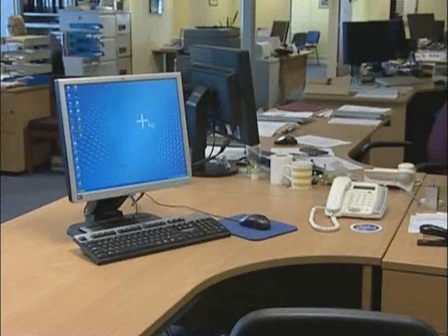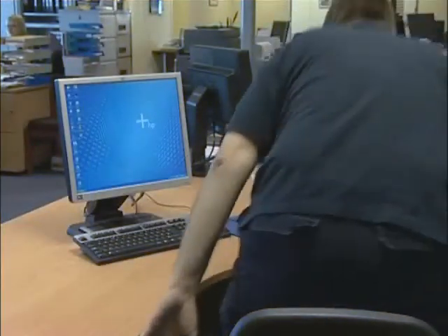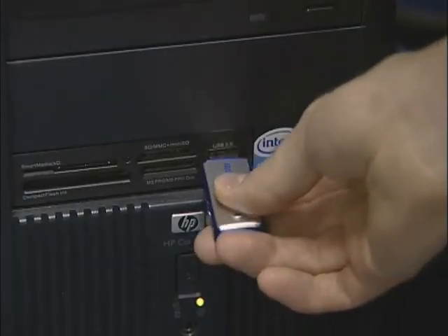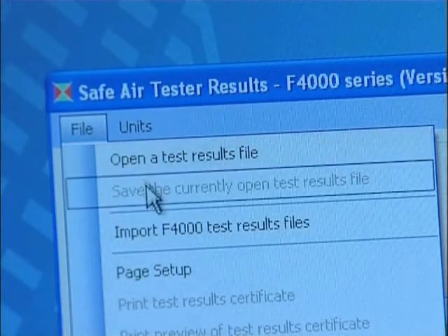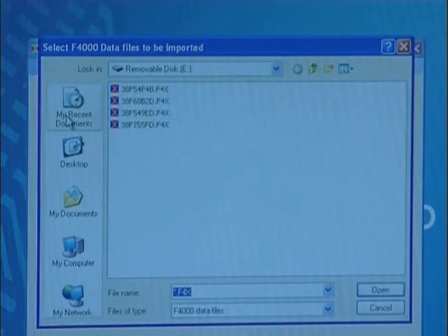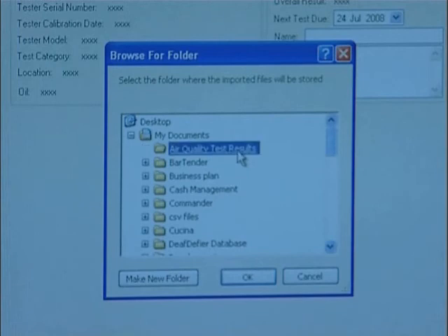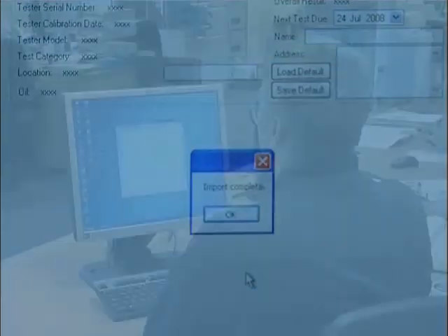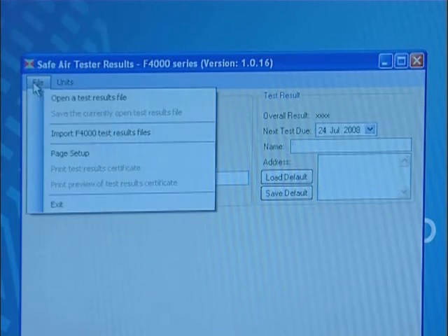Before you can import the results, you must first install the software on your PC. A copy of the software is available on the memory stick provided with this instrument. Making sure you have connected your memory stick to your PC, start the software and from the File drop-down menu, click on Import Test Results File and select the drive location for the memory stick. Multiple test results can be imported by left-clicking on the first and then holding the left Shift key and clicking on the last record, then click Open. You will then be able to choose the location where you'd like test results to be stored.